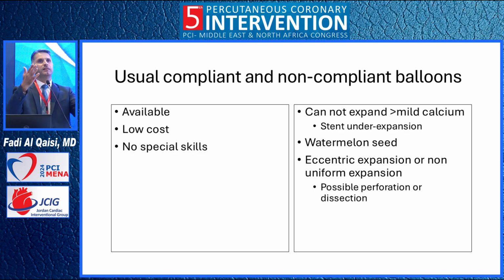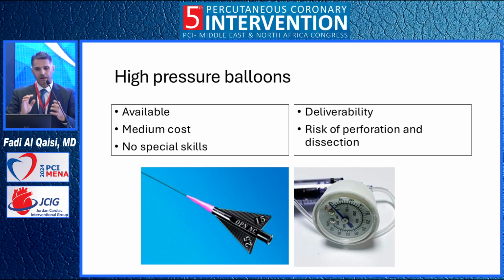Many of us rely on it: oh, look at the balloon, it expanded, that means I opened the plaque. Many times that's incorrect. You are expanding, favoring the adventitia, leaving the actual plaque itself, and that can risk your rupture and your perforation. High pressure balloons, we have it in Jordan, it's available. It has medium cost, close to the cost of the stent. It doesn't need any special skills. The disadvantage, it has low deliverability, it's a bulky device, and obviously there is risk of perforation and rupture.